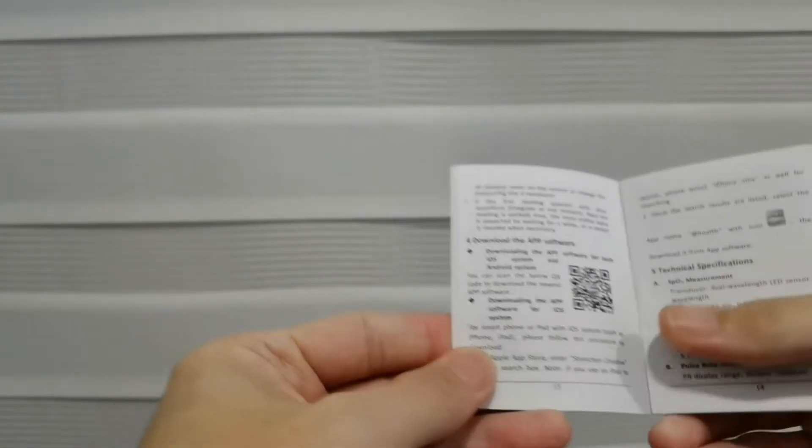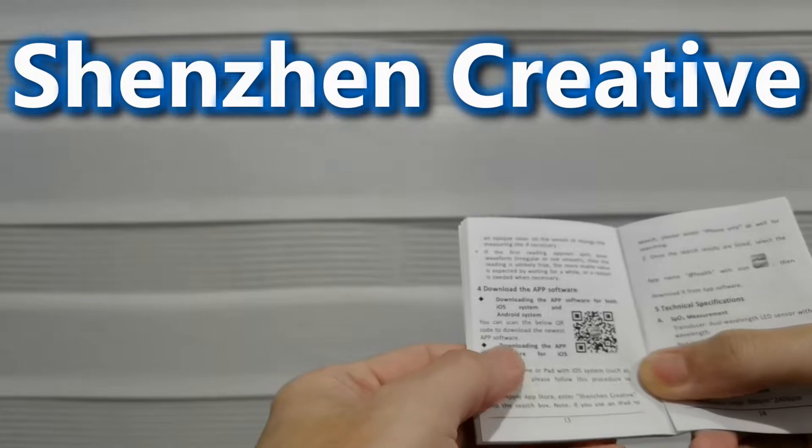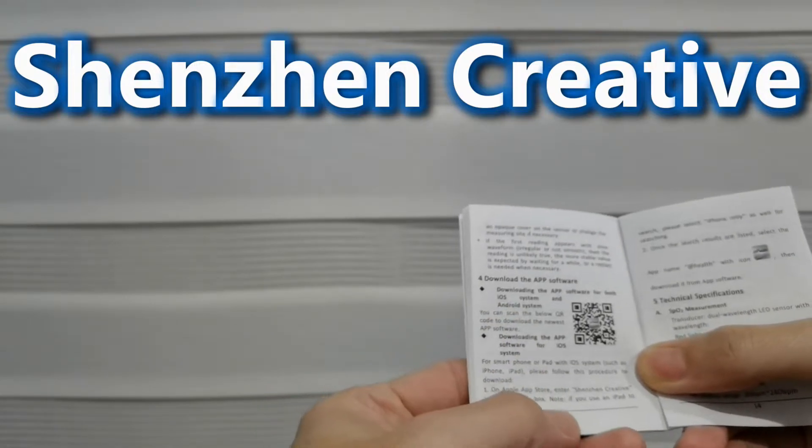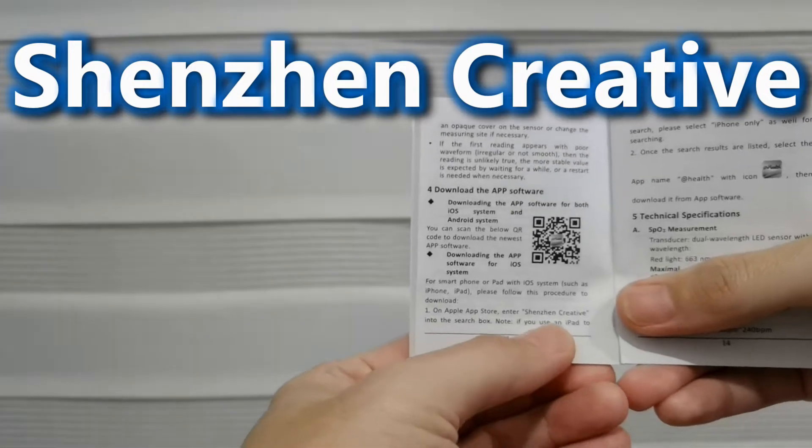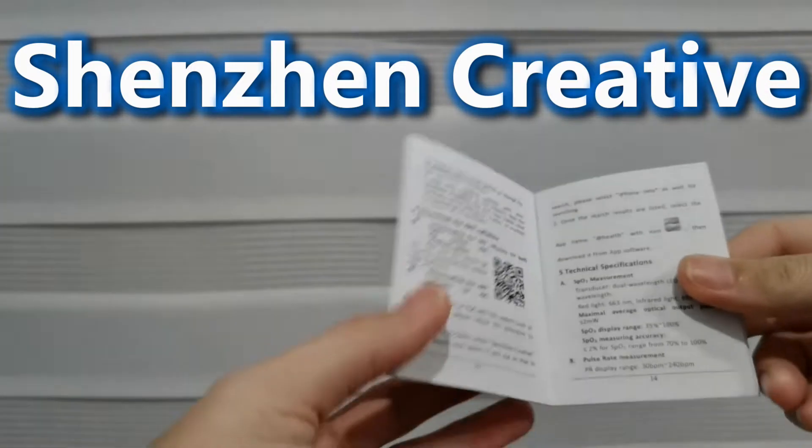Or you can manually search for 'Shenzhen Creative' and you'll also get this app.